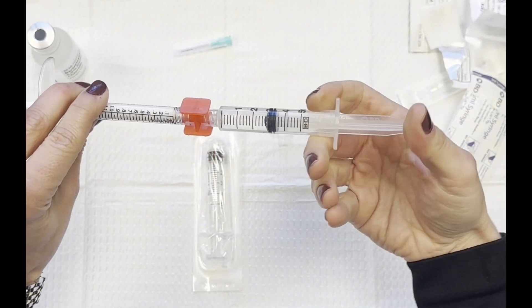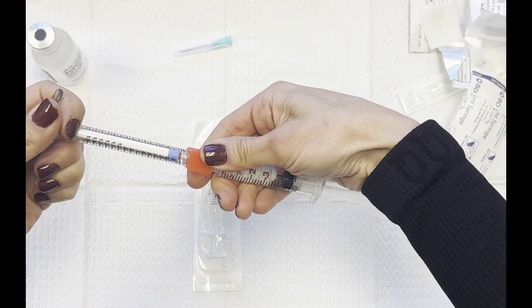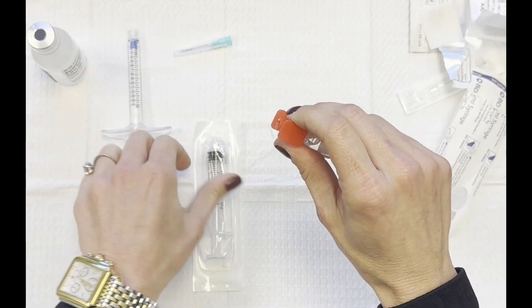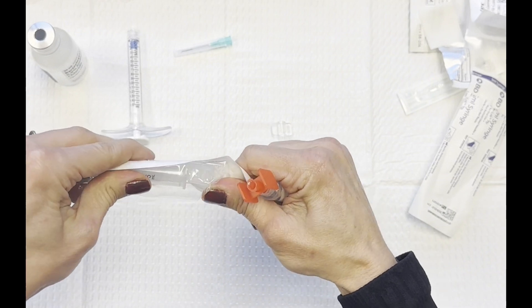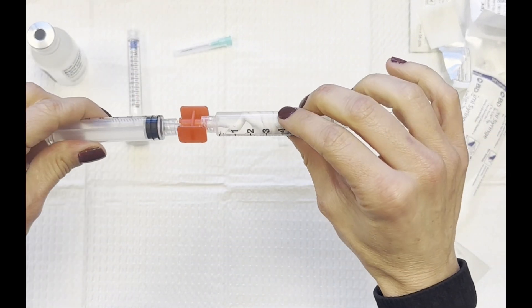And then push that Radiesse into my 5cc syringe. And you see, that's why I used a 5cc, so I have plenty of room to blend the product. Now I'm going to take my other 5cc syringe and connect the two together.